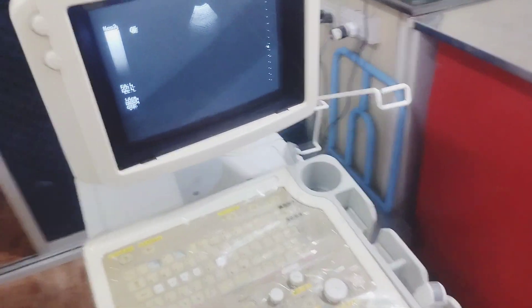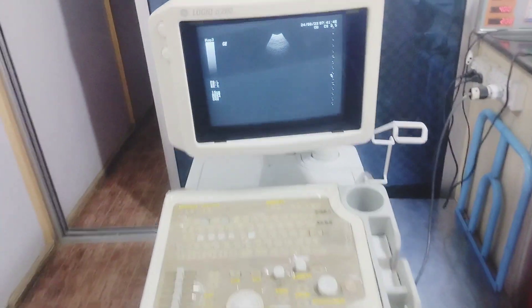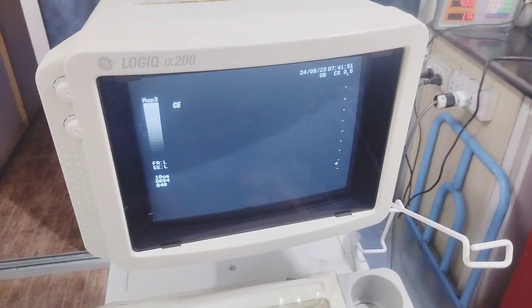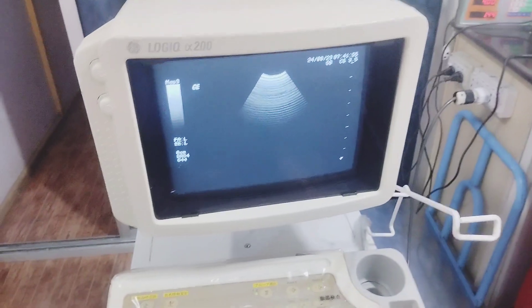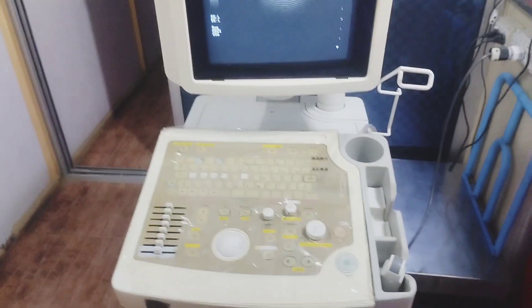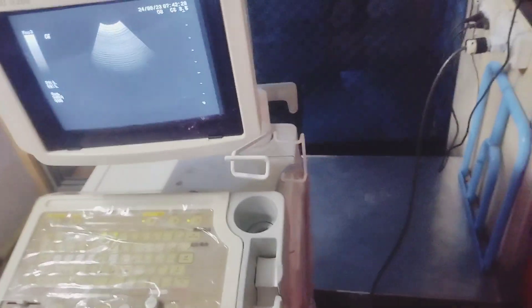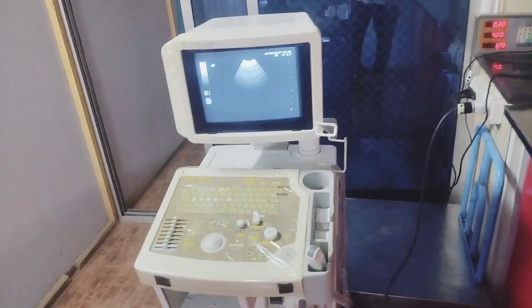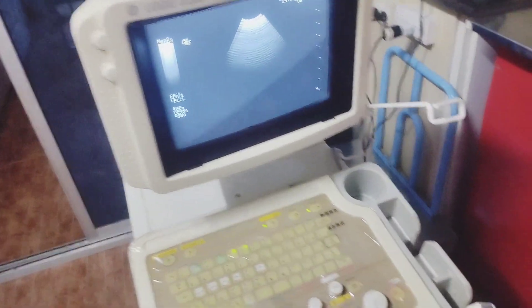It's an ultrasound. I am going to check the patient's video so you can see the results on this portable machine.